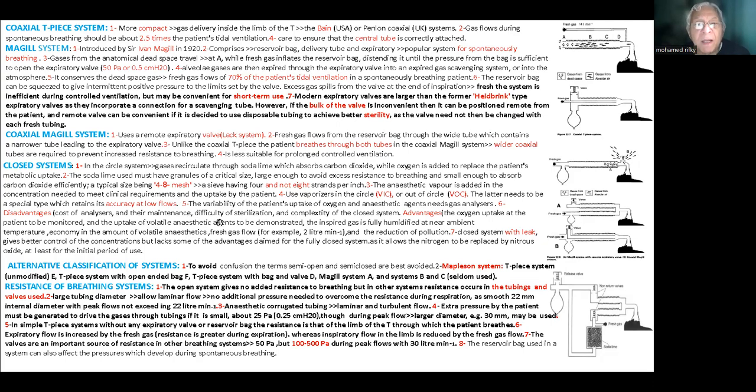It can be used, of course, during controlled ventilation. We can use the circuit outside or inside the circuit, and we have to have an accurate system to measure all this flow to minimize the drawbacks. The advantage of it, as we said, is that it uses less anesthesia and oxygen, and minimizes the loss of humidity.